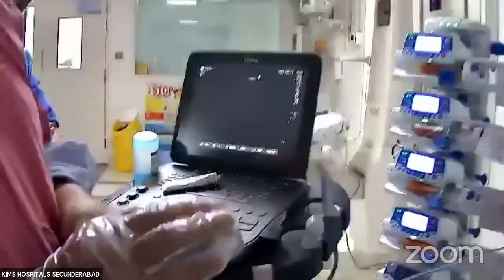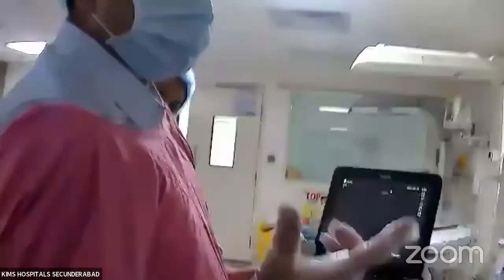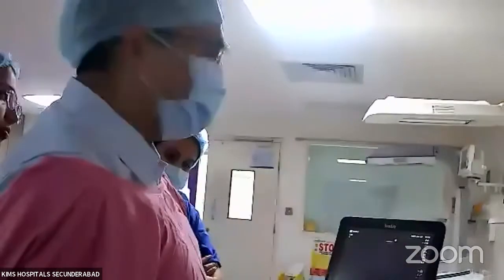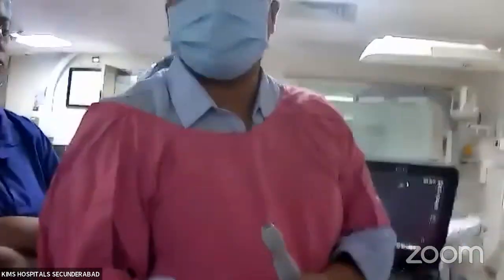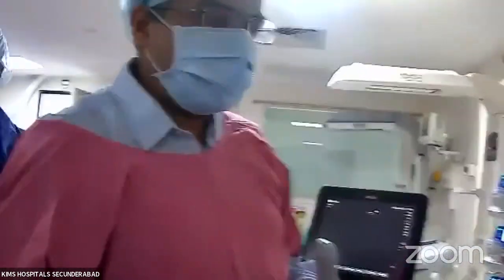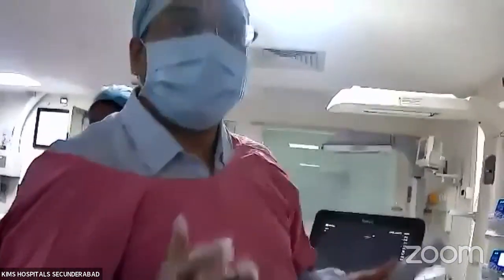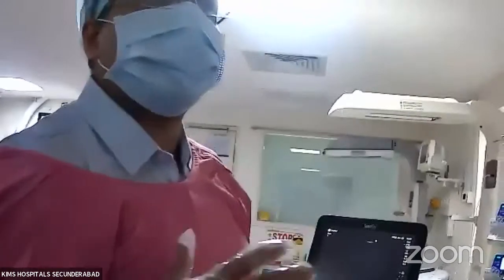So if you are able to do that, like pressure we told, IVC we told, then M mode we told, now TR and PR, how the pressure gradient across the shunt, what are the different views. The more you do, the more you'll be able to get it. So apart from that, always see the X-ray. Suppose you are not getting a view, pneumothorax or pneumopericardium will not allow us to see.